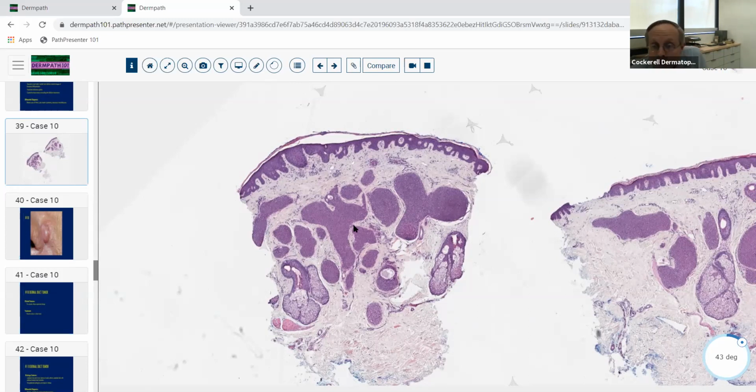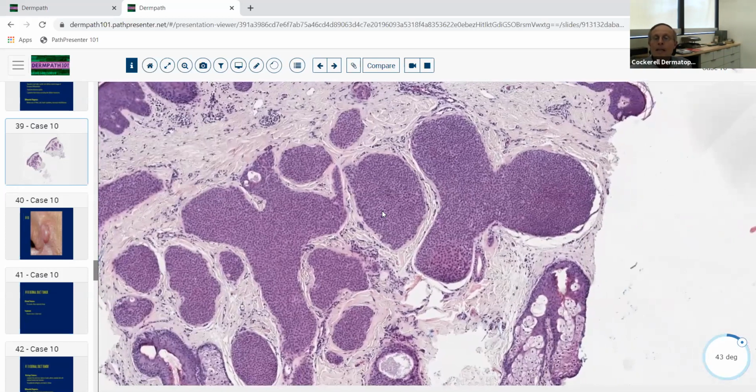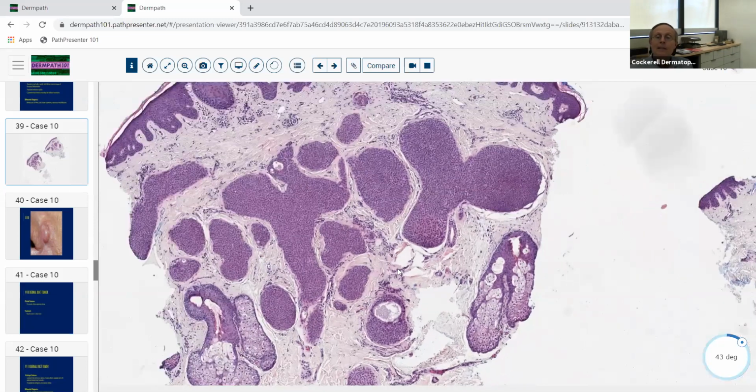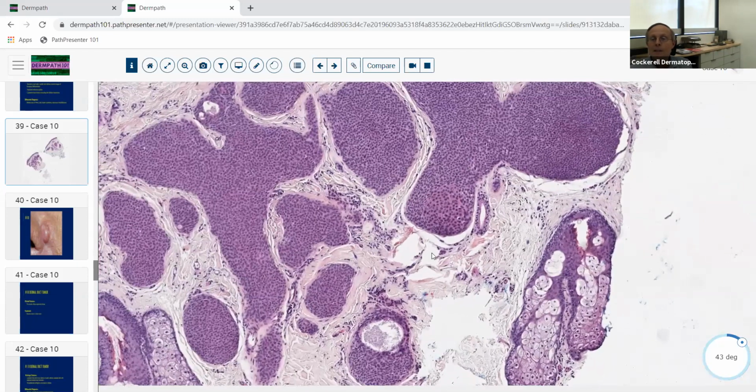The other thing you can do too, if you've got a punch out of a very large lesion, is look at the individual aggregations. So are these individual aggregations small? Are they symmetrical? Are they well circumscribed? Just like the palisaded encapsulated neuroma, those individual little aggregations were themselves recapitulating benign lesions just on their own. So is it epithelial or non-epithelial? Well, once again, it doesn't have a spindle-shaped morphology, so our first reflex then is to say it's more likely to be epithelium. And we want to ask ourselves what type of epithelium. So we've had sebaceous epithelium today, we've had squamous epithelium today, we've had follicular epithelium today. So we need to have one other type of epithelium, right, to be kind of complete.